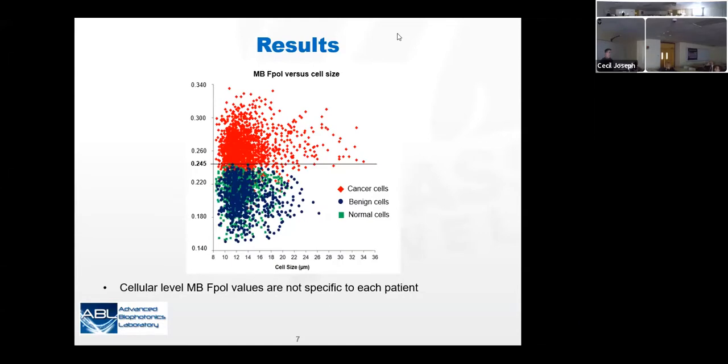And as we go forward, now that this feasibility study has been conducted, we're also working on enhanced sample handling and cell smearing protocols to further the translational development of the technology, so that it's something the pathologist would actually want to use.